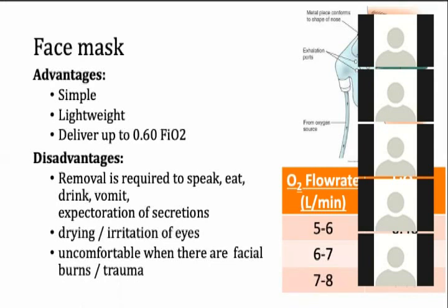The disadvantage is sometimes people do not like to keep a mask on their face, and they need to remove it if the patient wants to talk or eat or drink, and sometimes irritation to the eyes can occur because the gas can leak around the mask. Okay.